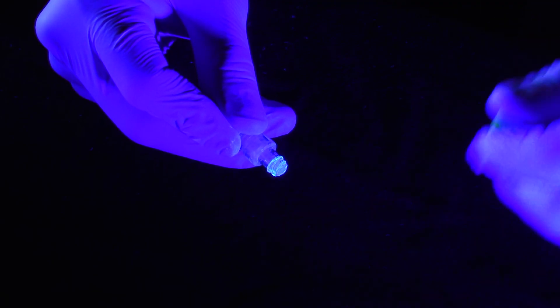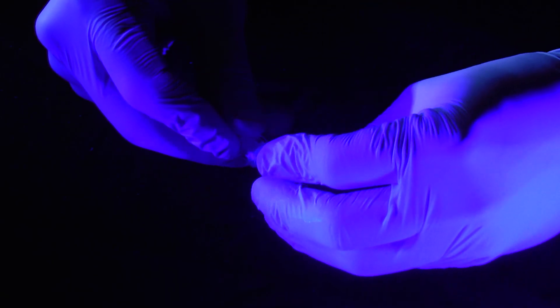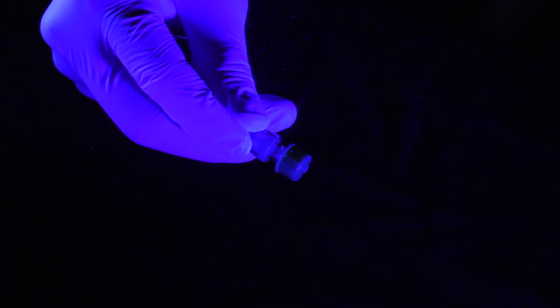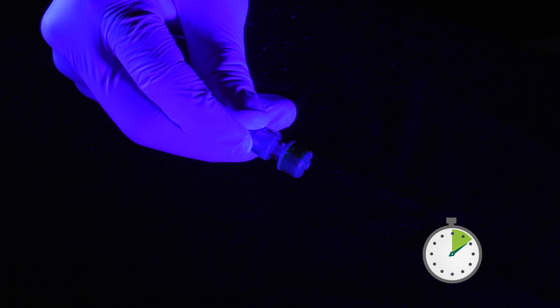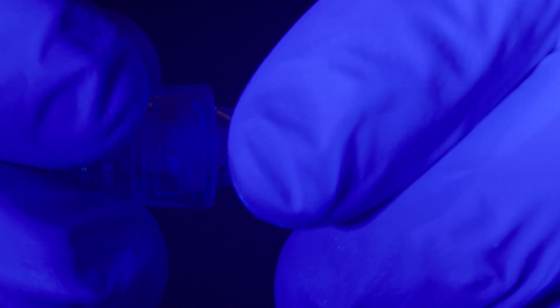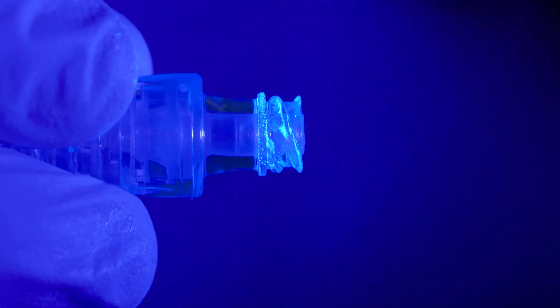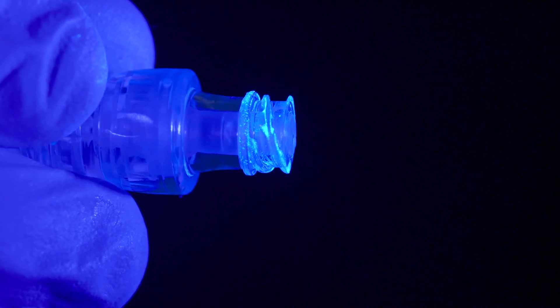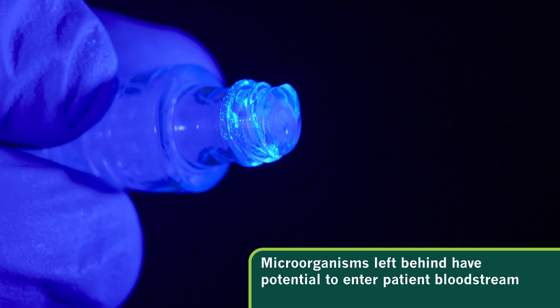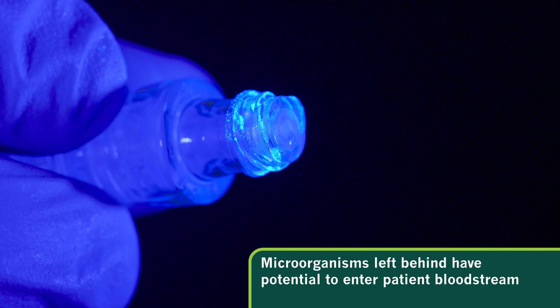Let's apply a standard alcohol disinfecting cap to the site. The instructions for use recommend letting the cap remain on the connector for a period of one minute. Without a physical scrub, microorganisms have not been removed from the septum and in between the threads. These microorganisms have the potential of being introduced into the patient's bloodstream.